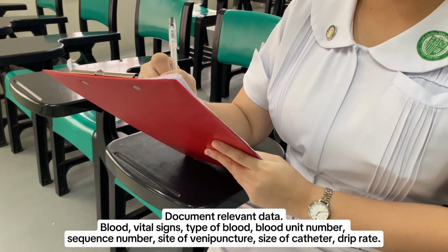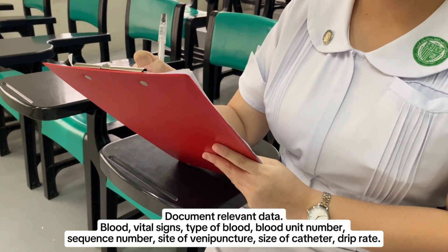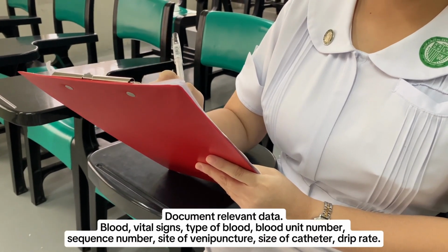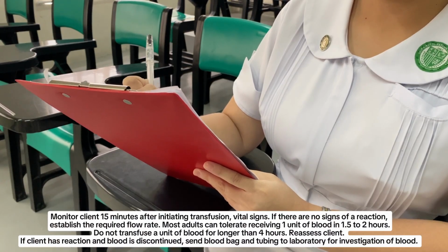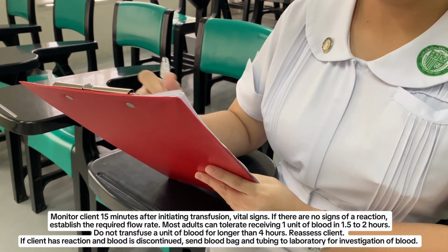Document relevant data like blood, vital signs, type of blood, blood unit number, sequence number, site of venipuncture, size of catheter, and drip rate. Monitor client 15 minutes after initiating transfusion, vital signs. If there are no signs of a reaction, establish the required flow rate.